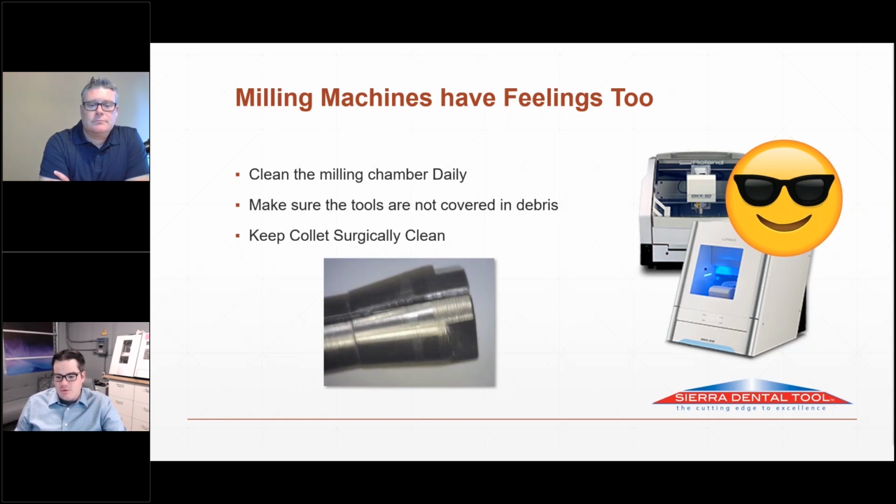And the more zirconia powder that you have in there, the faster your machine will wear out, and it's going to get loose over time, and then it's going to fail. So the difference between running a machine that's cleaned on a regular basis and never cleaning it and just neglecting it, you could cut the service life of the machine in half by neglecting it. It's pretty easy to do. So you're paying that bill. You may as well get the most out of it.